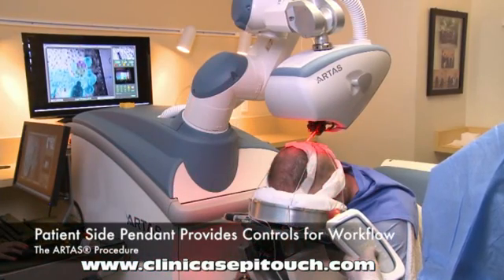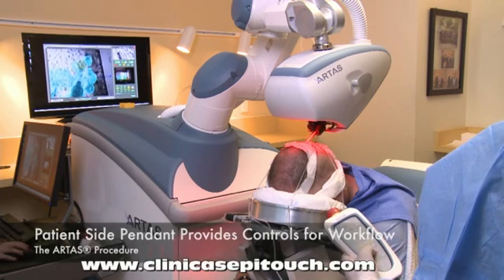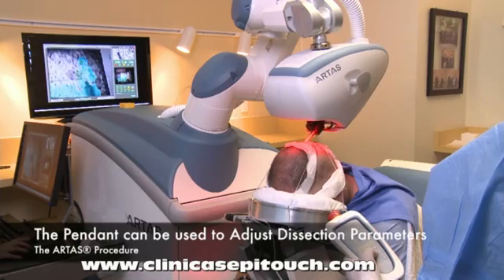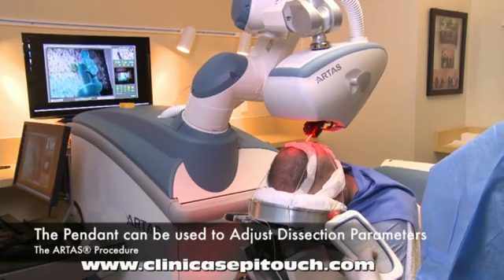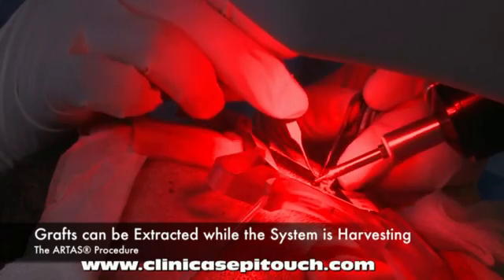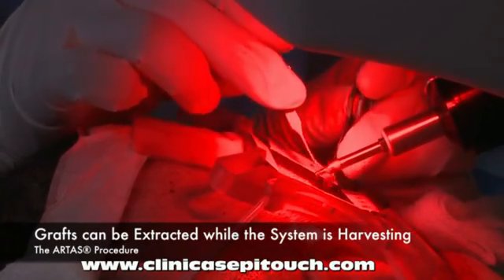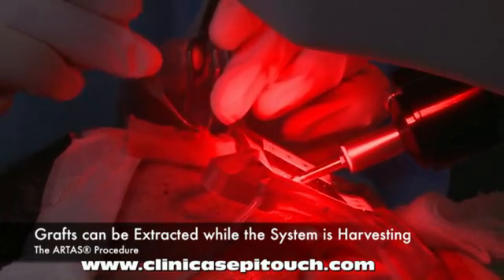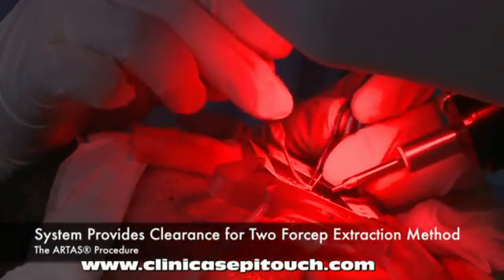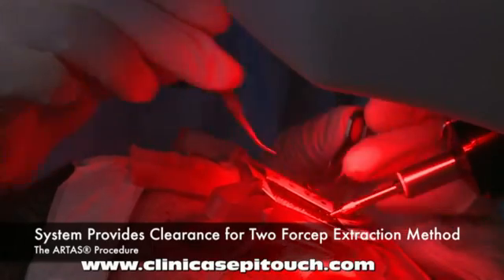The patient side operator utilizes a pendant. This pendant provides controls for the workflow we've just described, and can also be used to adjust dissection parameters during harvesting. To enhance efficiency, grafts can be extracted while the system is harvesting. The system provides sufficient clearance for use of the two-forcep extraction method.